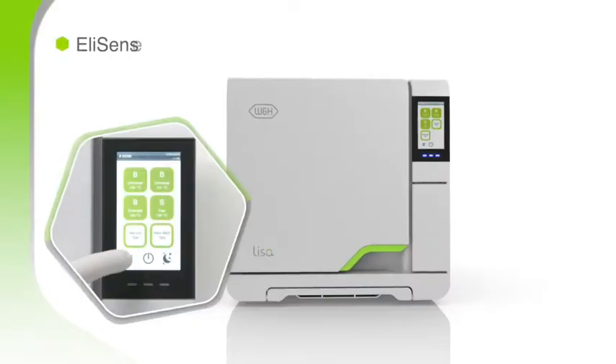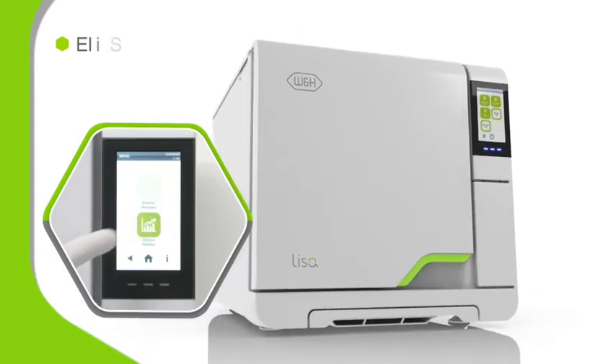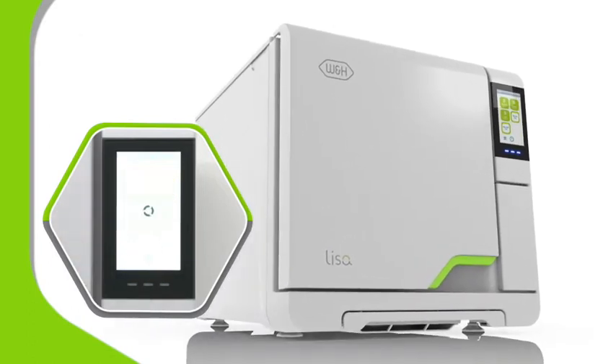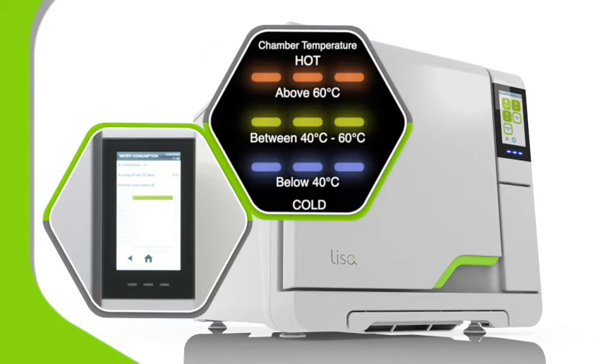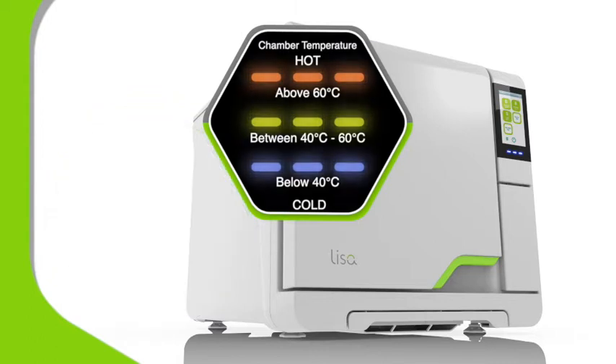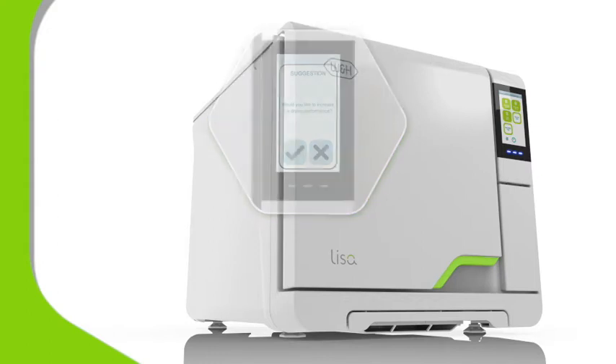Thanks to Ellysense, Lisa's sensors record and analyze sterilizing cycles to help optimize your workflow. This means you can tap to learn the current cycle status or internal temperature. And Lisa learns too, use by use, passing on analysis as on-screen prompts suggesting how you can improve efficiency.